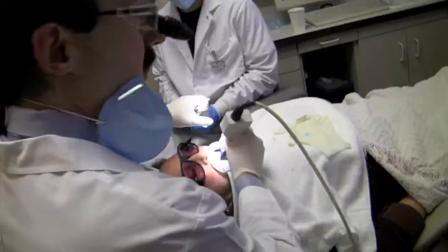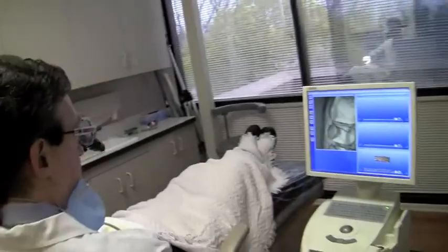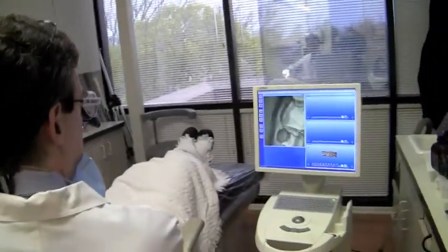We need to go back — and I say this from clinical experience. In other words, I'm a wet-finger CEREC dentist. I'm in the trenches like you guys are, doing multiple restorations. Where your technique of your optical impression and reflective medium style shows up is in multiple teeth, particularly if you're doing a quadrant or doing veneers.